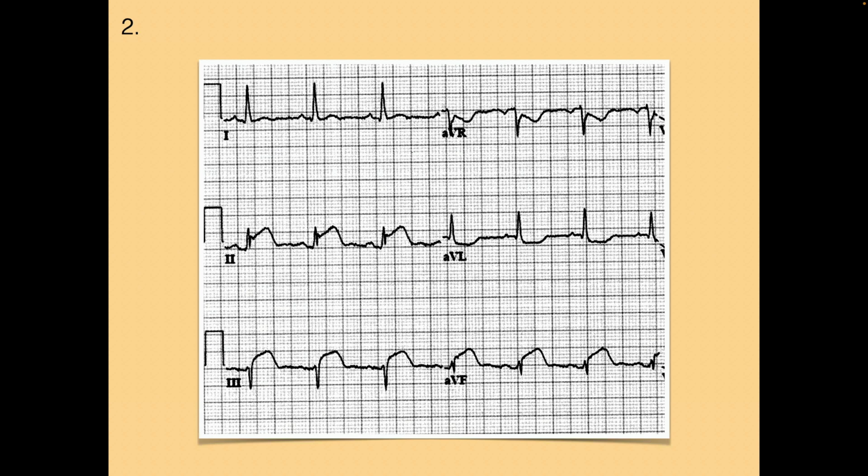Questions? There's a little bit of depression in aVR. Would that make you think about doing a right-sided? No. You would definitely do a right-sided, but it has nothing to do with aVR. As we'll learn, right-sided leads are almost always done in conjunction with inferior. So you would look for a right-sided because of the inferior.